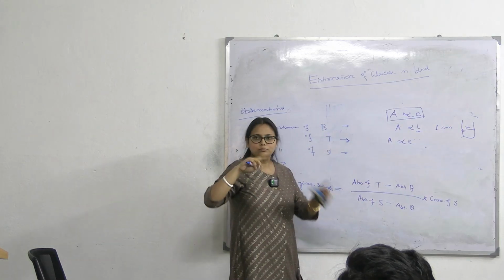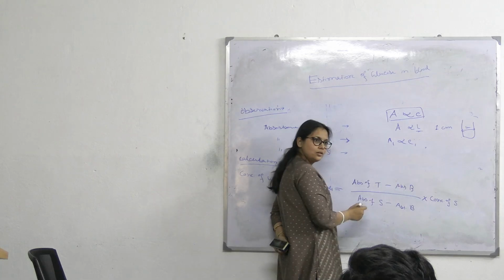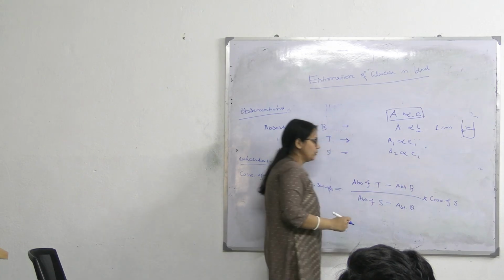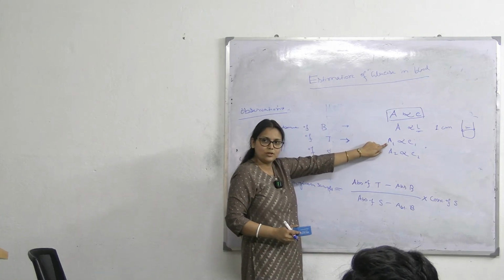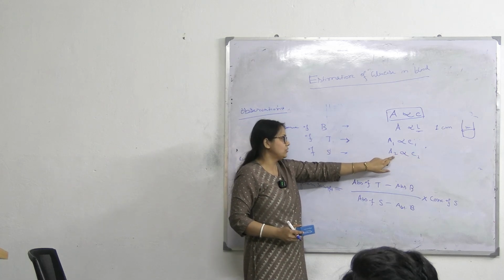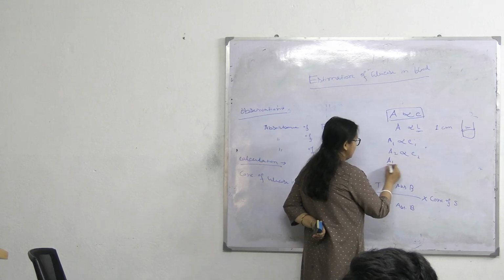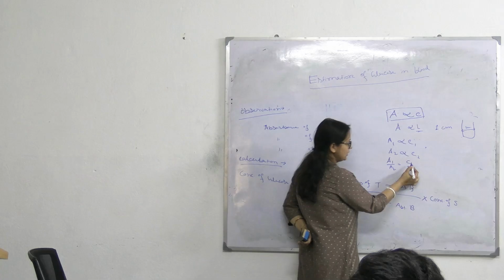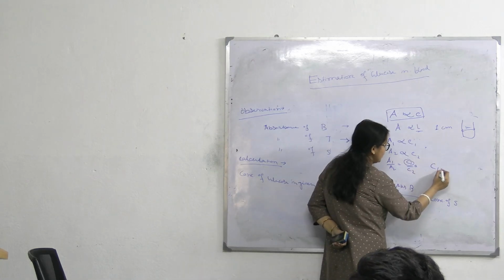If we take two different samples, A1 will be proportional to C1 and A2 will be proportional to C2. মানে এর ক্ষেত্রে ধর এটা যদি ব্লাড স্যাম্পলের অ্যাবজর্বেন্স A1, তাহলে A1 is proportional to C1 আর স্ট্যান্ডার্ড সলিউশনের A2 is proportional to C2, তাহলে A1 by A2 is equal to C1 by C2. তাহলে এটা যদি তোর ব্লাডের হয় C1, তাহলে C1 equal to কত হবে?